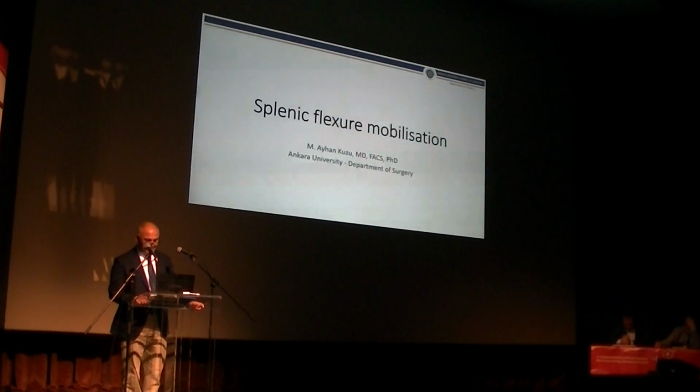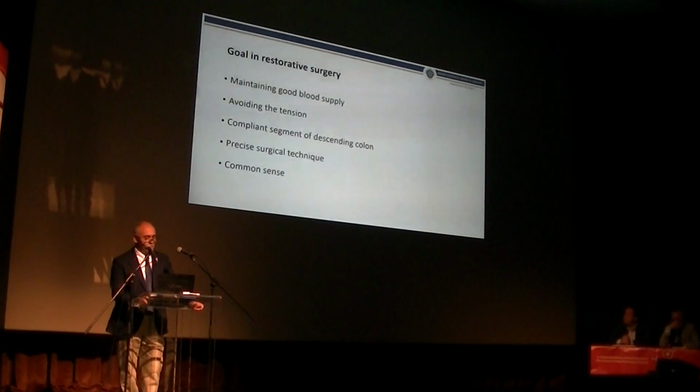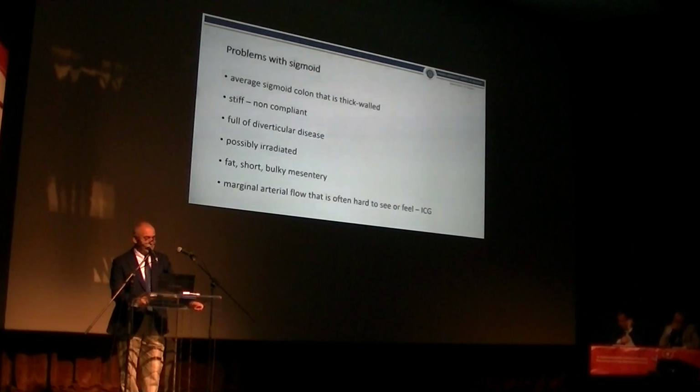Thanks for having me. I'm just going to show a couple of videos regarding splenic flexure mobilization. It's our goal to restore the bowel continuity while maintaining a good blood supply and avoiding tension. In order to do that, we need a compliant segment of descending colon with precise surgical technique and common sense.